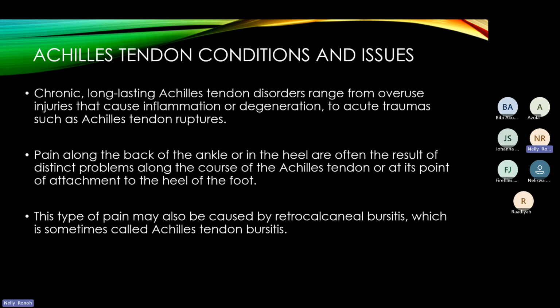Pain along the back of the ankle or the heel is often the result of distinct problems along the course of the Achilles tendon, or at its insertion point, its attachment, or the plantar fascia as a referred pain, because some patients could tell you they're feeling pain around this area, vaguely. They would give you the heel, sometimes extending to the back of the leg, the posterior part of the ankle. That is why in most cases when we are assessing the Achilles tendon, we don't do it in isolation. You have to push your probe further to check the plantar fascia.